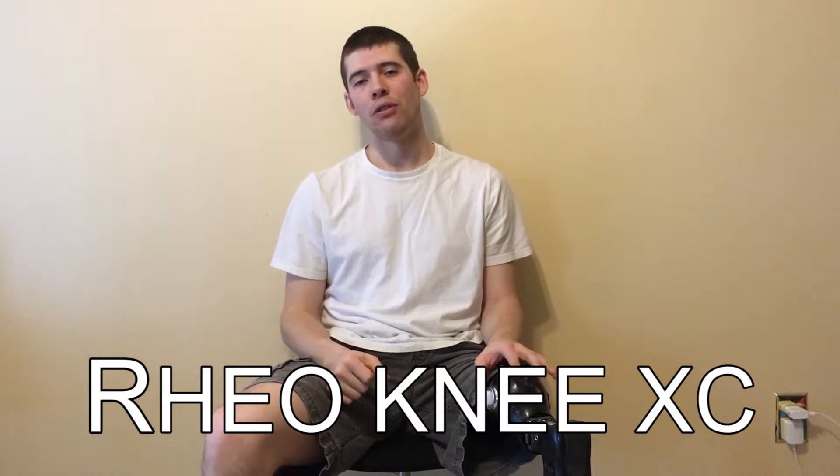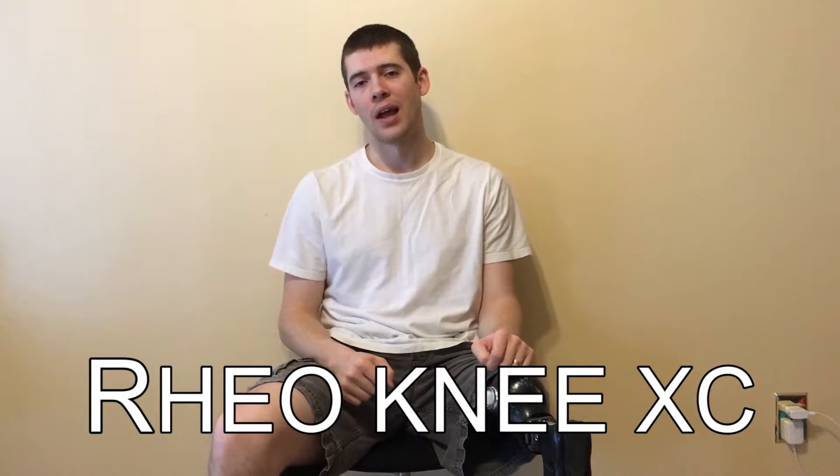Hey YouTubers, it is me Wes and today I am going to be reviewing the Rheo Knee XC by Ossur. I got this knee about six months ago and I've had plenty of time to use it and get a feel for how it operates and how it suits my daily needs. Last February I had the opportunity to go to Iceland to test out the knee and also to test out the new features of this knee.